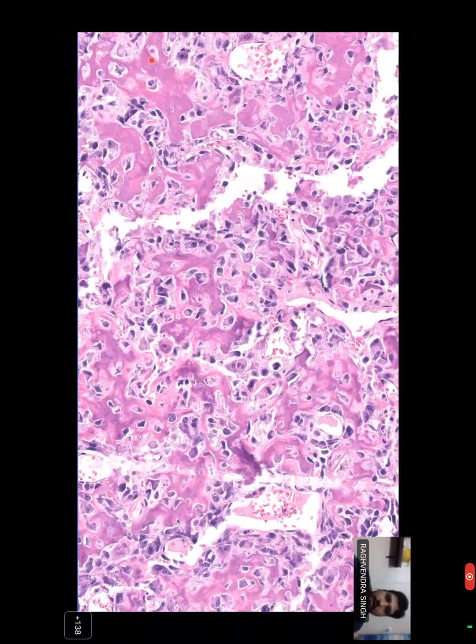True, there are some osteocytes, there's some lamellar structure, but the way it is deposited, right? It's deposited in this sort of filigree pattern. It's sort of this irregular network of pink material that is very typical of bone formation. And in addition, it is mineralized, so it's not been over-decalcified as in the previous sample. You see this blue material.